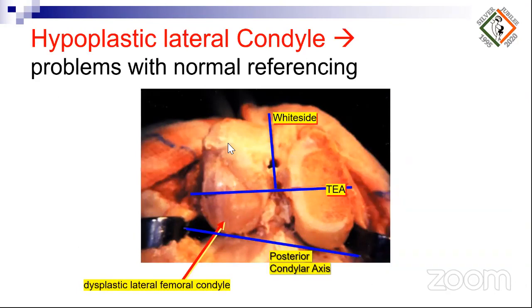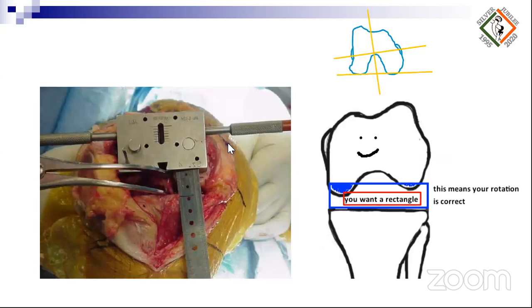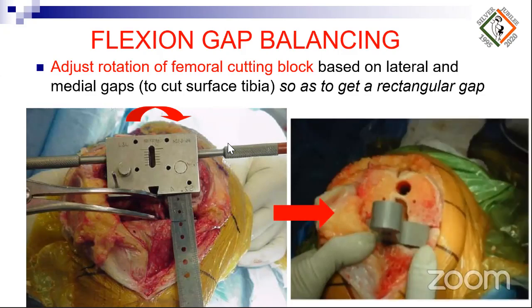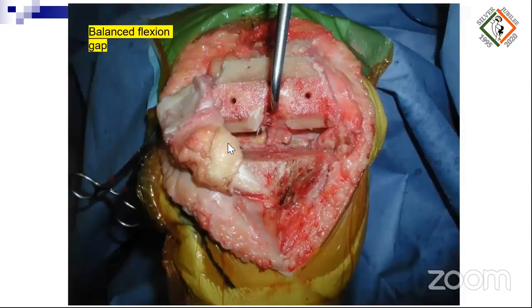there is a hypoplastic lateral condyle, and this causes problems with normal referencing, as a result of which you want a rectangle. The way to achieve this is by balancing your flexion gap by adjusting the cutting block, so that you end up with a rectangular gap. After you've made your cuts, you should be able to put in your spacer, and it should be parallel and well balanced. Once the block is out, you should have a space that looks like this. At the end of your chamfer cuts, this is the way that the patient's knee looked. Again, a rectangular gap, which is well balanced.